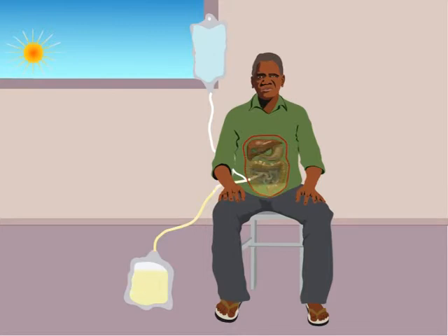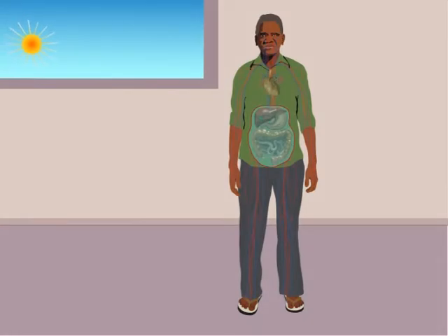You let out the used water, which goes out into the empty bag. Then you fill up again with the cleaning water. Every time you fill up with cleaning water and let out the used water, that cleans your blood and your body.